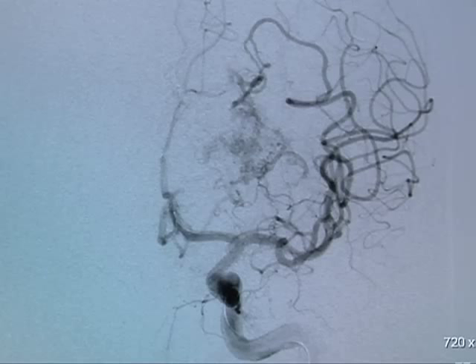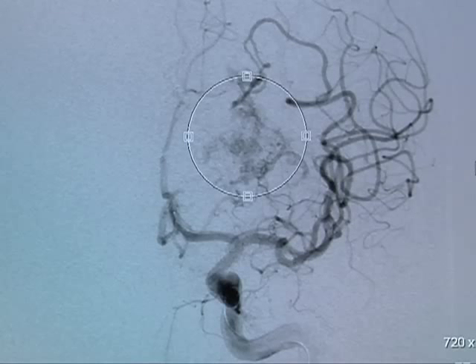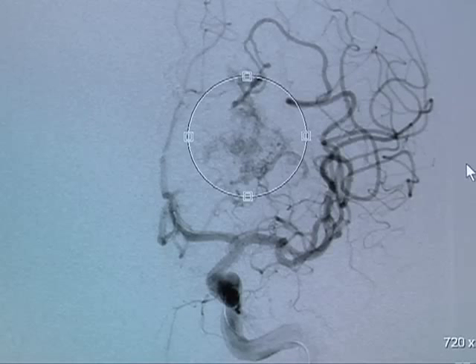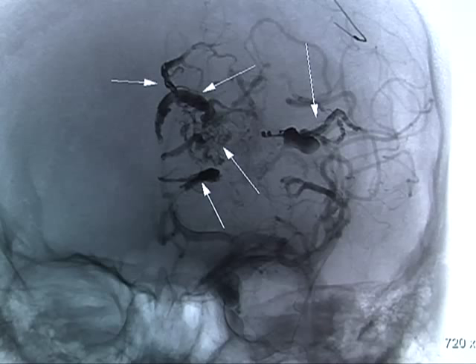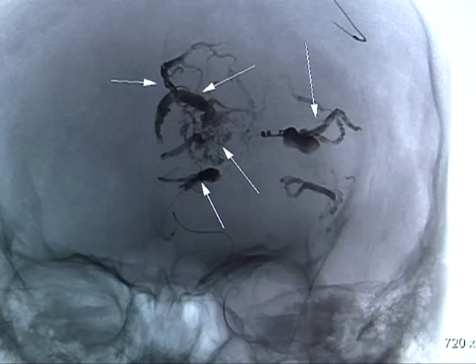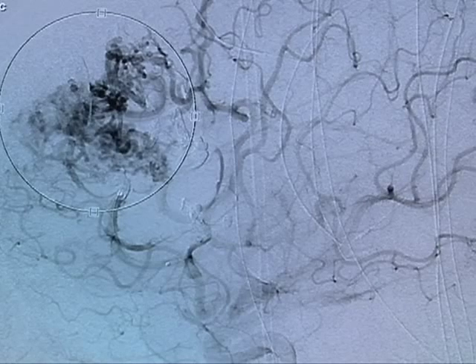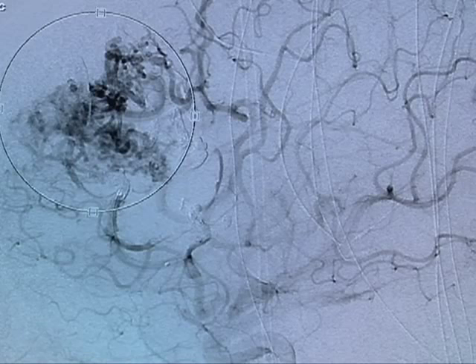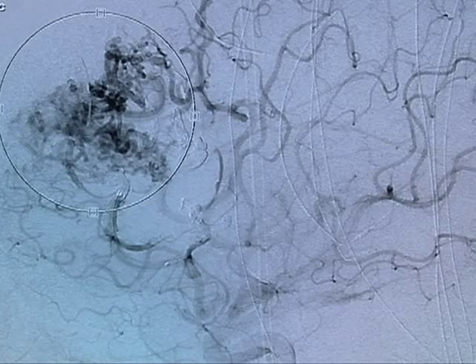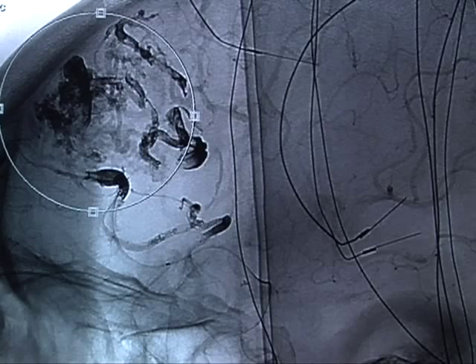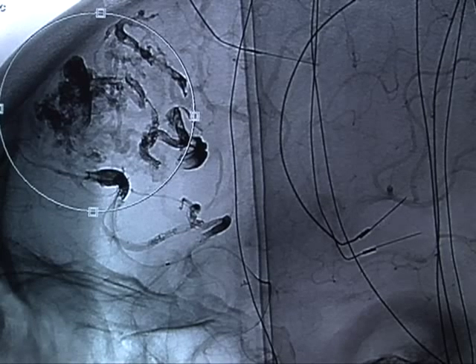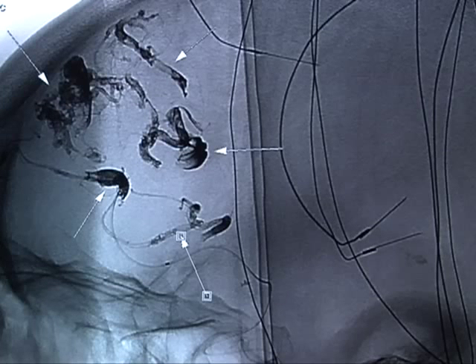This is the AVM after embolization. The volume has been significantly reduced. This is an anterior-posterior view, and the circle shows the residual arteriovenous malformation. The arrows point to the Onyx material within portions of the AVM and feeding vessels. We have embolized both anterior cerebral supply and middle cerebral supply to the lesion. In the lateral view after embolization, primary supply now comes from one middle cerebral artery branch. The dark material with the arrows represents the Onyx.